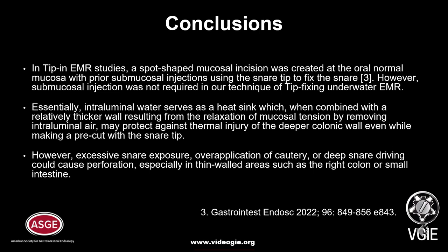However, excessive snare exposure, over-application of cautery, or deeper snare driving could cause perforation, especially in thin-walled areas such as the right colon or small intestine.